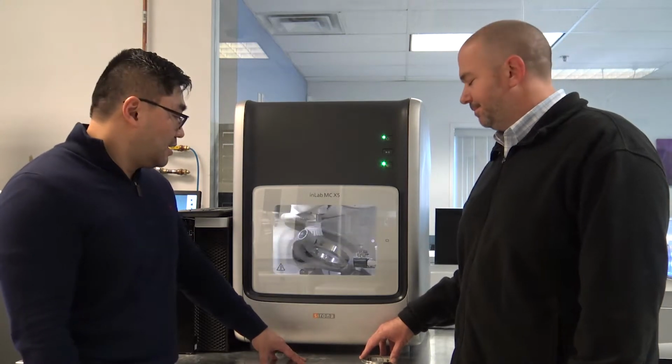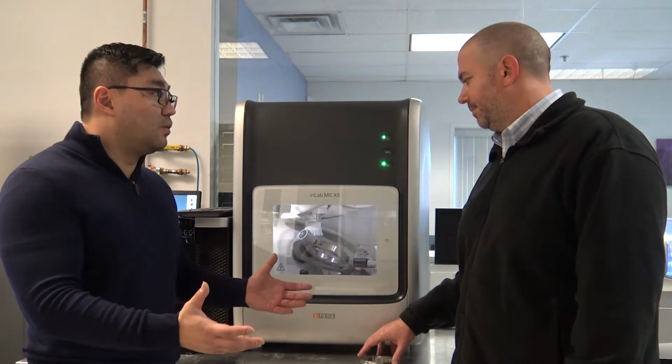Correct. Okay. Approximately how long does it take to mill 1 crown? Zirconia maybe about 18 minutes. 18 minutes, okay. And you do have different production types as well. So if you're doing a coping, you can choose it to mill a little bit faster versus a full contour crown. Sure. So the time does vary. You can mill a little bit faster than 18 minutes if you really want to.